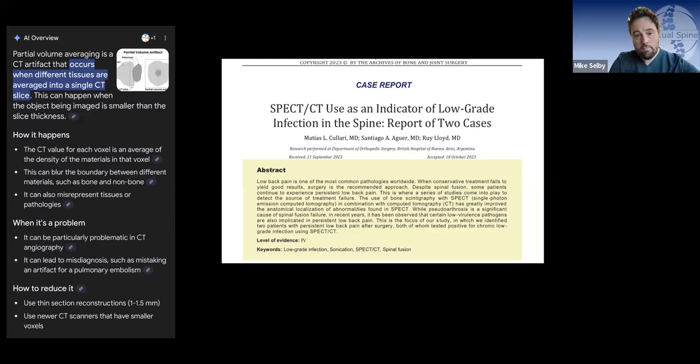And so it can overcall, misrepresent the amount of bone in a section. Look, I think CT is a little more accurate when you're dealing with PEEK and carbon fiber cages or bone-on-bone fusion. I think in the presence of metal, the volume averaging is particularly problematic. Look, it can be reduced, and there are various CT algorithms to do that, but it remains a big area of problem in reporting of spinal instrumentation.